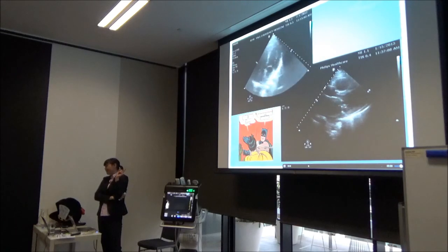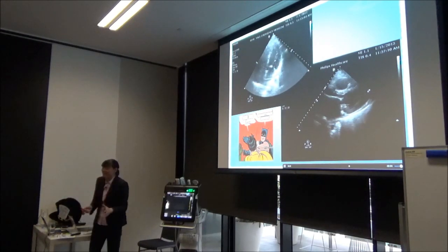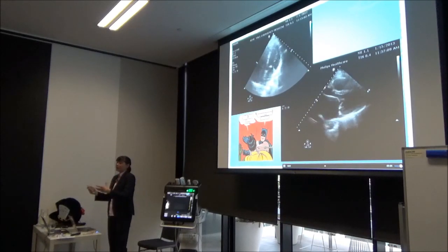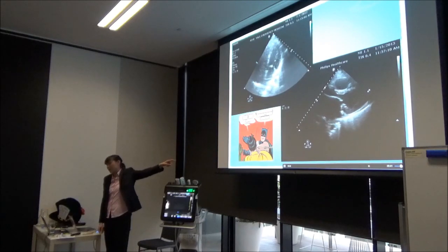You guys like these memes? Don't shock asystole. Okay, so I'm not saying to shock asystole, but I'm saying if you see asystole or PEA, we should be taking a look with ultrasound to make sure this isn't happening.